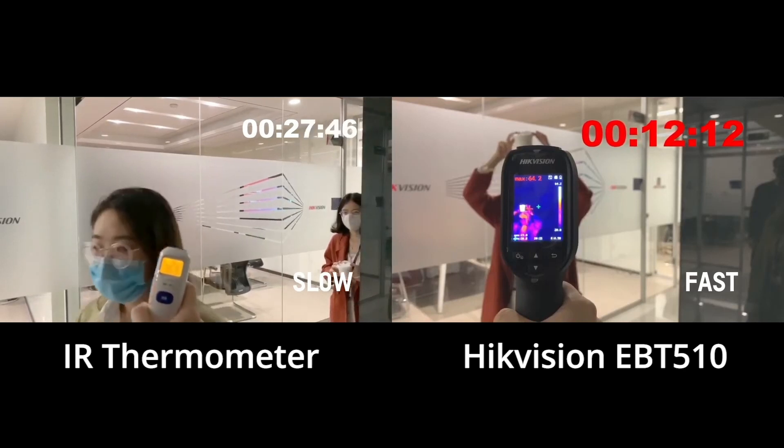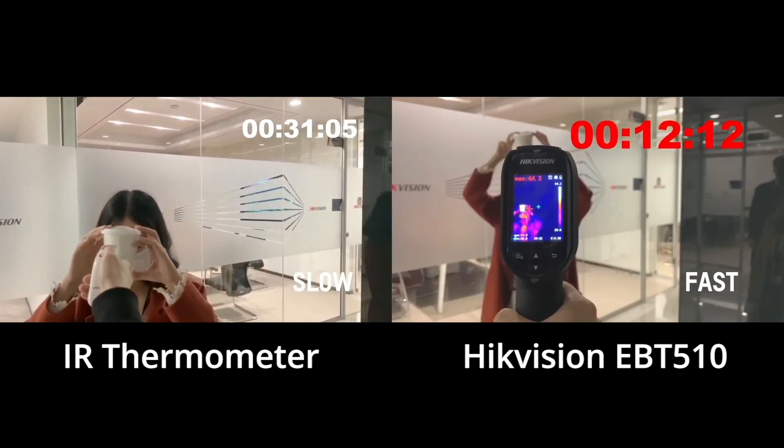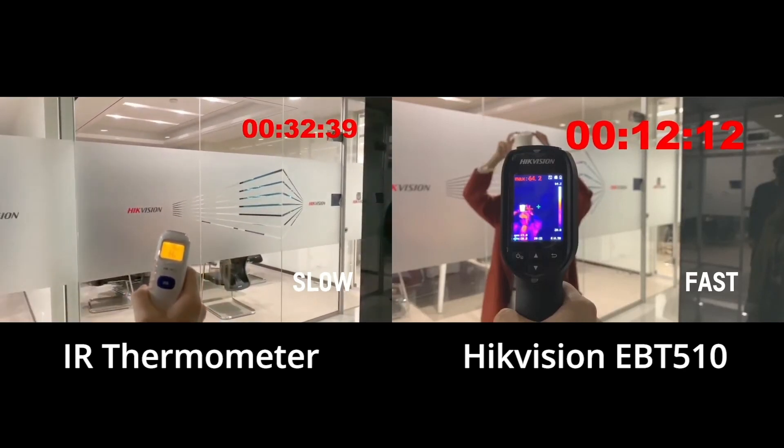With the EBT-510, subjects can be much further away, which helps to ensure everyone's safety. Now, we've finally scanned 5 people with an infrared thermometer. You can see that total testing time is more than double versus the EBT-510.